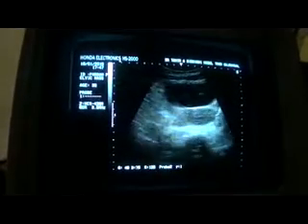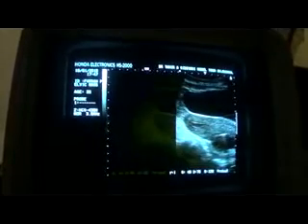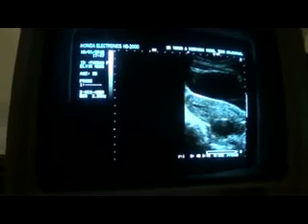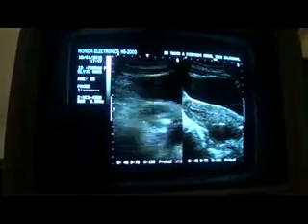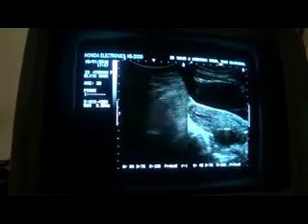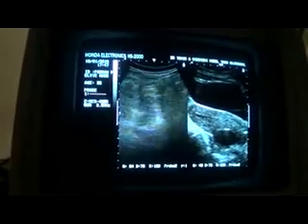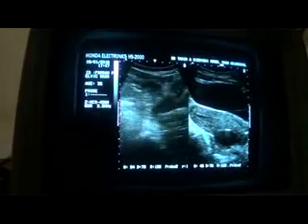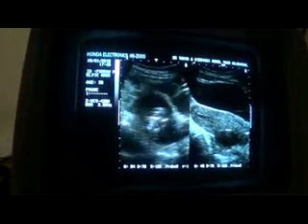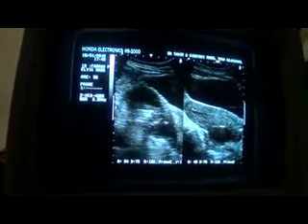So another typical case by transabdominal approach. Once again, a short review. No adjacent adenopathy was seen during my initial scan in this patient while she was having an inadequately filled urinary bladder. So this is our case of the day.